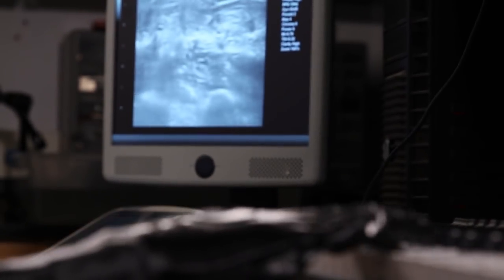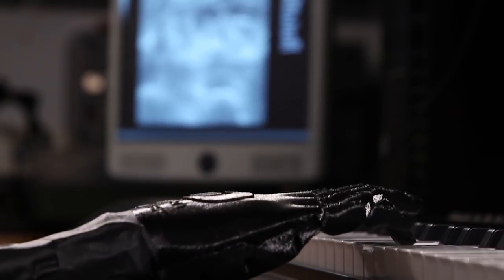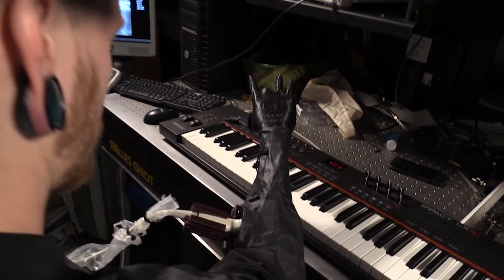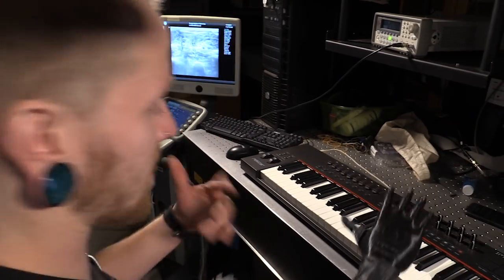That information relates to finger-by-finger control. Different fingers make the muscle move differently in different directions — sometimes to the left, sometimes to the right. We can do machine learning to detect all of these patterns and be able to predict what finger the amputee is trying to move. This is crazy.